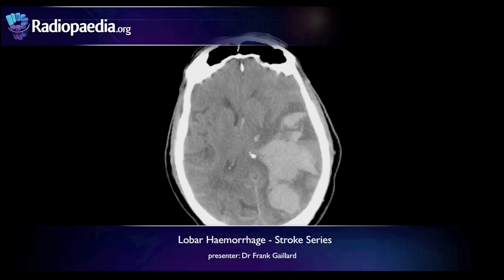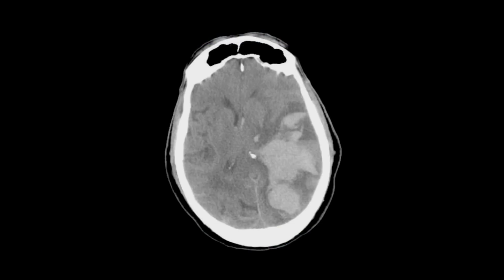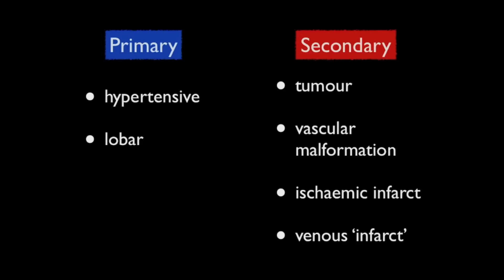Hello, this is Frank Gaillard from Radiopaedia.org, and today we will be looking at lobar hemorrhages. As we saw in our previous video on hypertensive hemorrhages, intracranial hemorrhages are typically divided into primary and secondary, according to whether or not there is an underlying lesion. Primary hemorrhages are further subdivided into hypertensive and lobar hemorrhages, although these two have underlying specific pathologies.